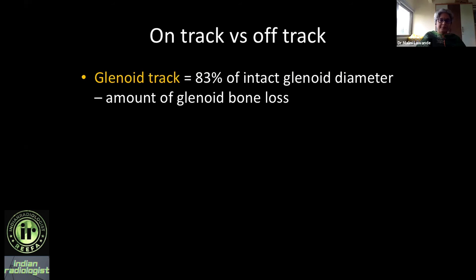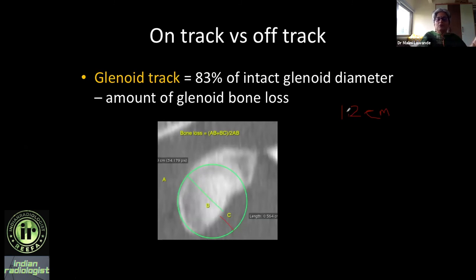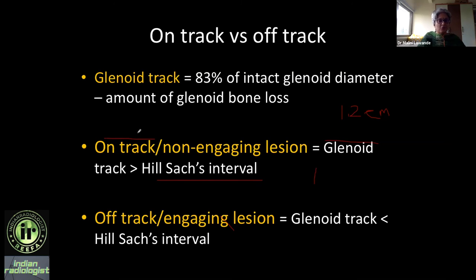The concept of on-track versus off-track: measure the glenoid track by taking 83% of the intact glenoid diameter and subtracting the bone loss amount. Then measure the Hill-Sachs transverse dimension — the Hill-Sachs interval. If the glenoid track is larger than the Hill-Sachs interval, it is an on-track lesion. With significant bone loss he does a Latarjet; without significant bone loss, soft tissue repair only.